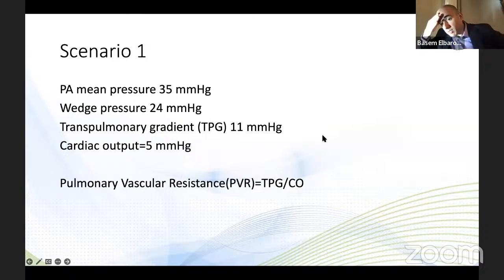Dr. Oakley commented on the role of right heart cath and biopsy post heart transplant. Patients who are post heart transplant need frequent routine myocardial biopsies. Early in the transplant, it happens on a weekly basis, then on a monthly basis, and then once a year for a while, to monitor for early signs of cellular rejection, because it's important for the heart failure docs to pick that up early to be able to adjust the immunosuppression modality.